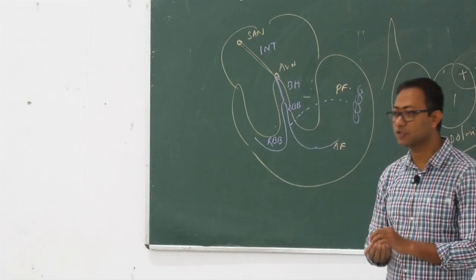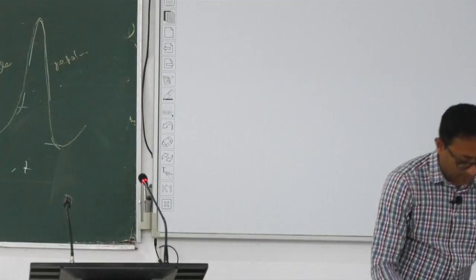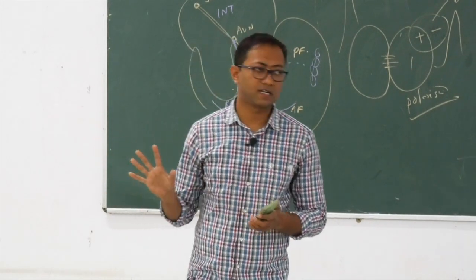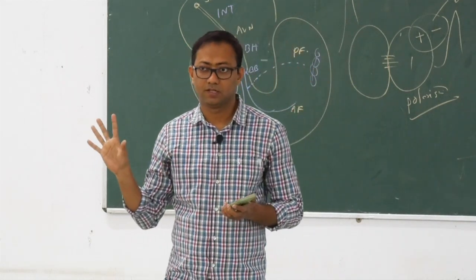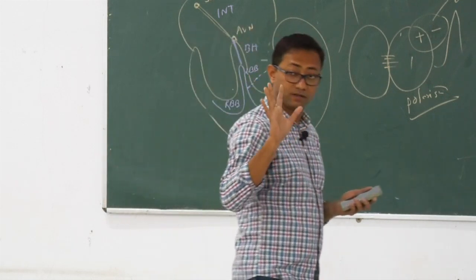Now you need to know the supply of electricity from one point of the heart to another. There are two vectors you need to identify and remember to understand ECG waves.